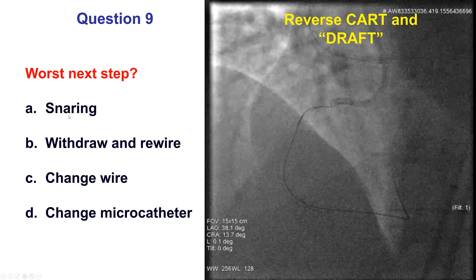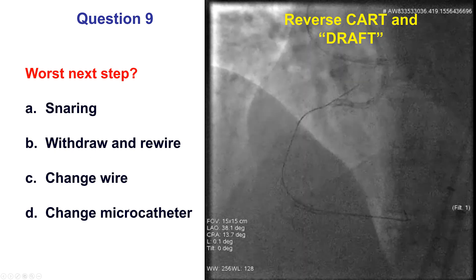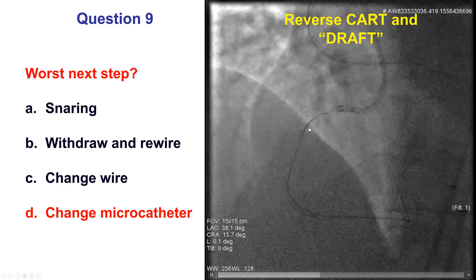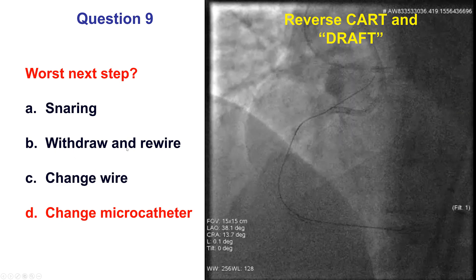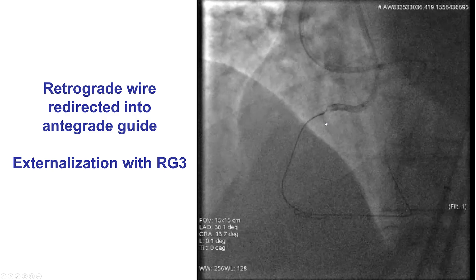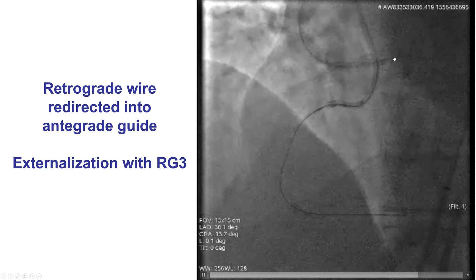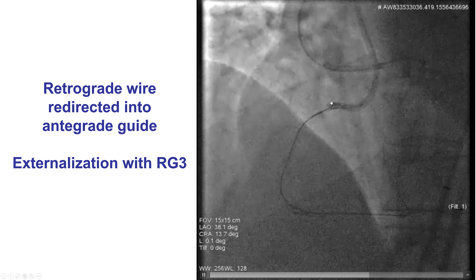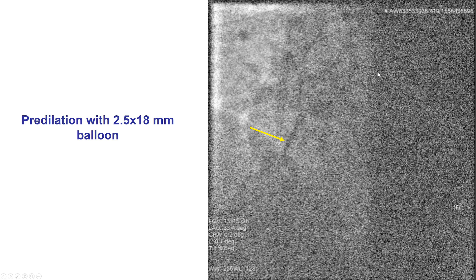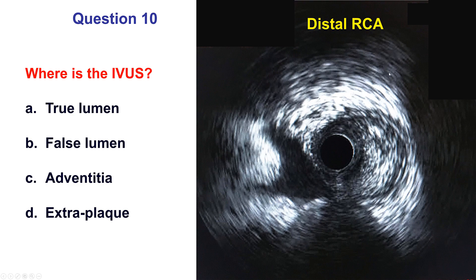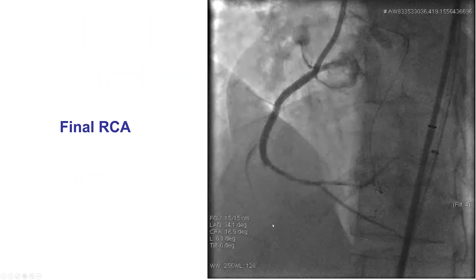In these cases, what would be the worst step? To snare, to withdraw and rewire, to change the wire, or to change the microcatheter? Obviously, you don't want to change the microcatheter because you have it in a very strong position, but everything else is an option. What we did here is just withdrew a few times and rewired, and eventually the wire found its way into the antegrade guide catheter. The wire was trapped, the retrograde Caravelle was advanced into the guide catheter, and then we externalized with RG3. We predilated and stented the right coronary artery with a long drug-eluting stent, providing a nice result.